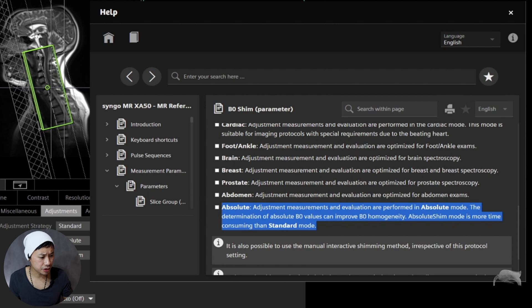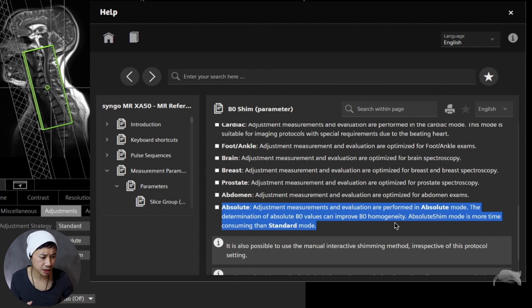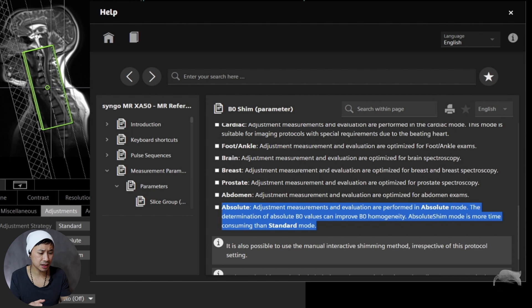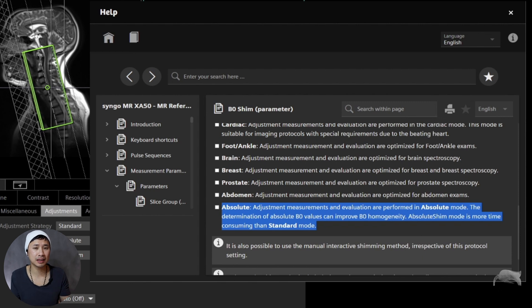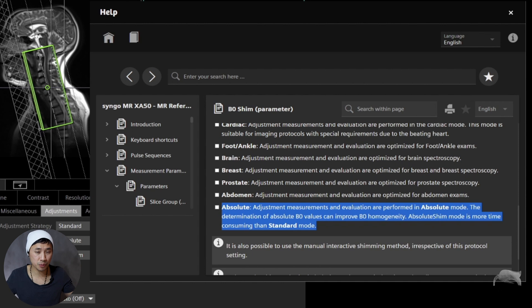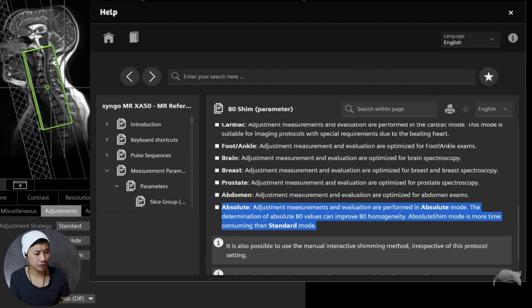According to the help function and user manual — you can press F1 on the keyboard to access it — absolute adjustment measurements and evaluations are performed in Absolute mode. The determination of absolute B0 values can improve B0 homogeneity. The manual also says Absolute mode is more time-consuming than Standard mode, but I'm not sure about that because when comparing Standard to Absolute mode I felt the scan time was the same. I would dive into that to figure out if it's longer by seconds or by minutes — I really believe it's only seconds, because I wouldn't have noticed if the protocol had extended significantly.